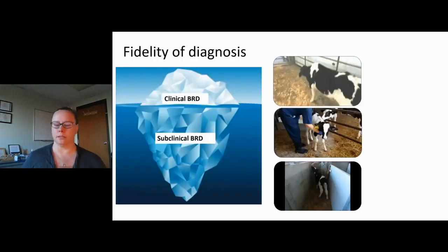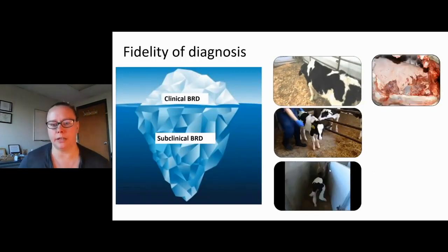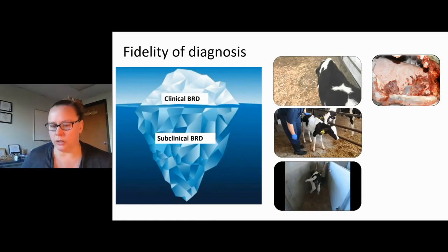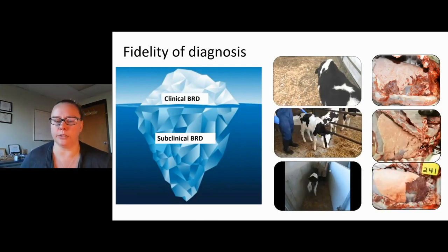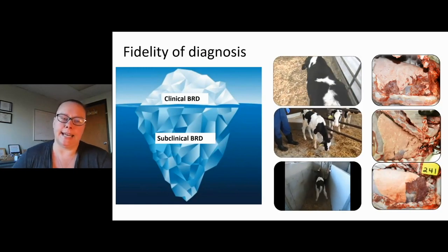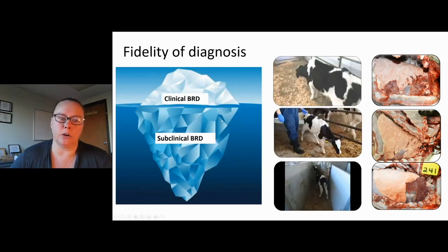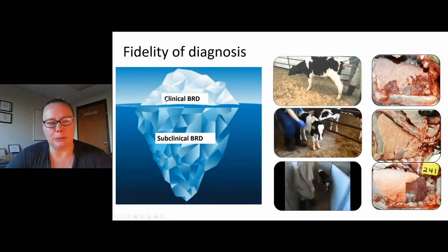So I'm going to show you some videos here to highlight that difference between clinical and subclinical pneumonia. We've got 3 calves here, and I think about this as a bit of an iceberg effect. So, we talk about iceberg type diseases.